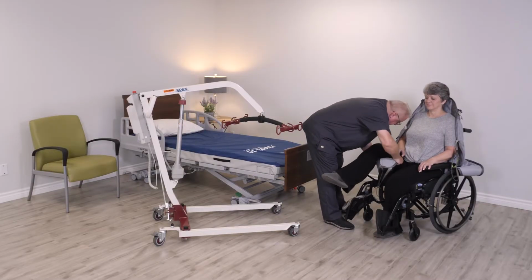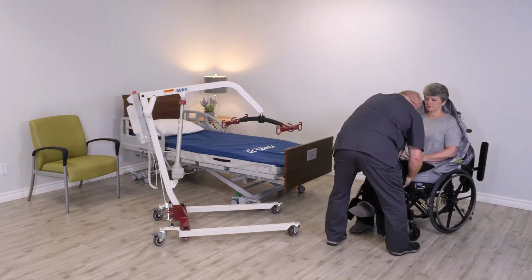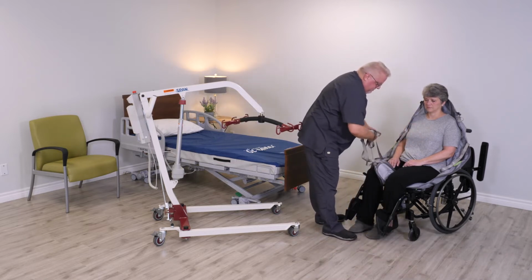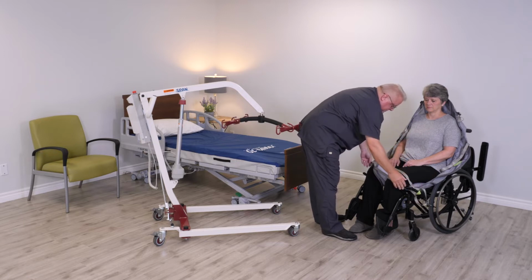Lift one leg and feed the leg strap underneath the thigh. Repeat the process for the other leg. Once the leg straps are under both thighs, take the straps and crisscross one through the other and lay the straps on the legs of the patient.